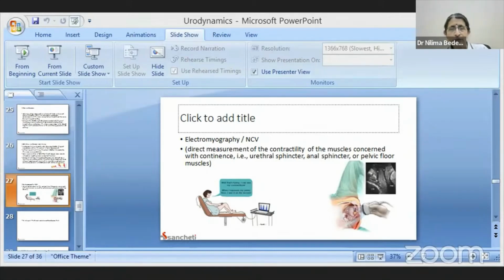Still, of course, a 3 months conservative trial will be given. The pelvic floor muscles need to be strengthened, so we'll discuss that. But they want to ensure the stability of the bladder before the TVT or other procedures. So this stress incontinence can also be checked with urethral pressure profilometry.